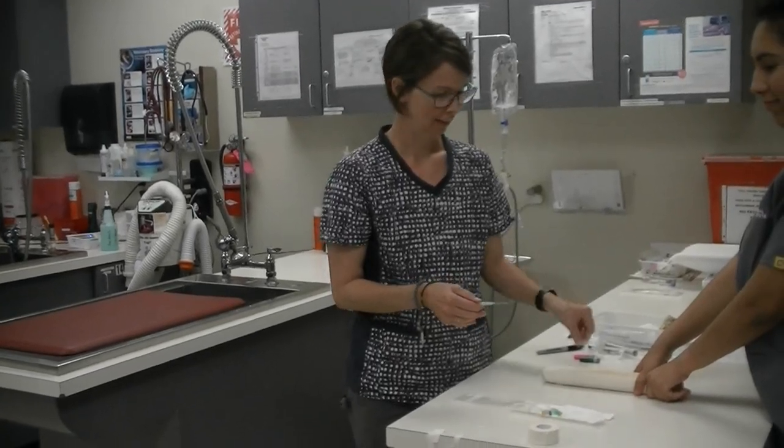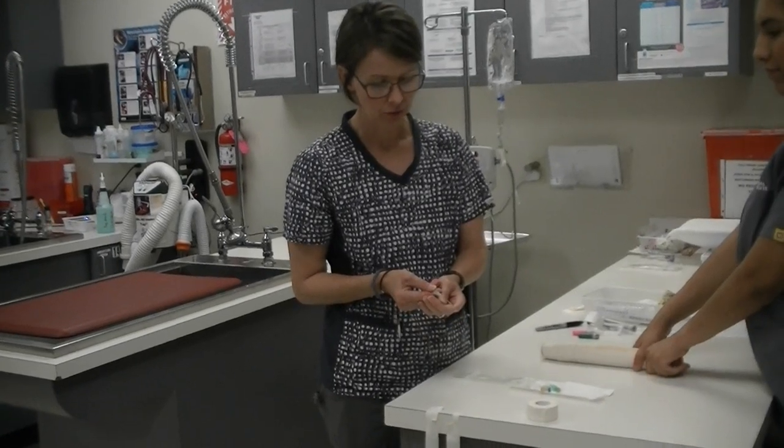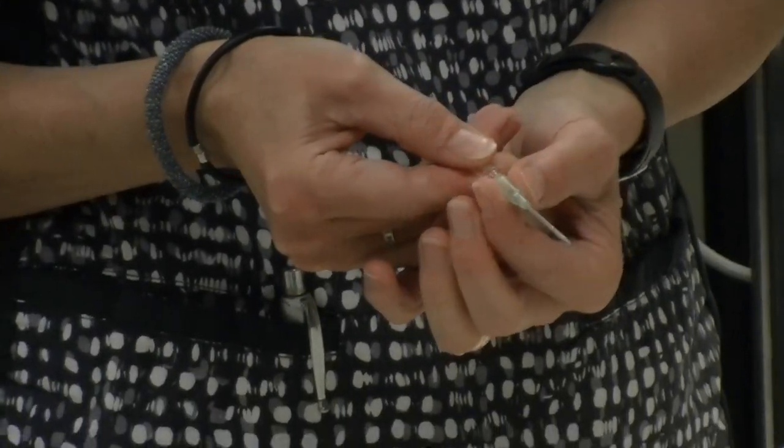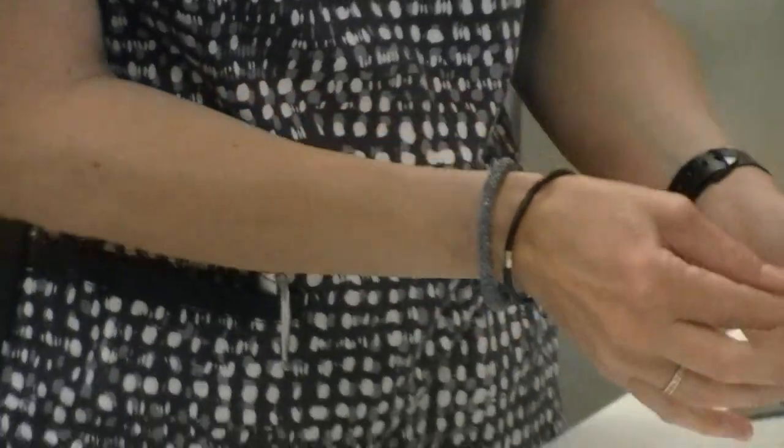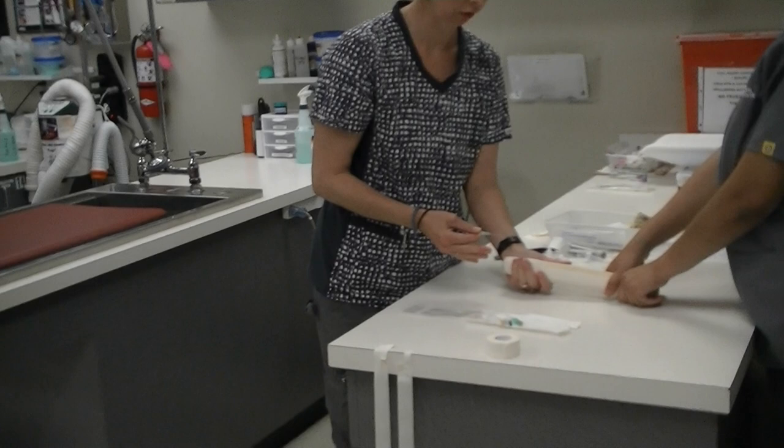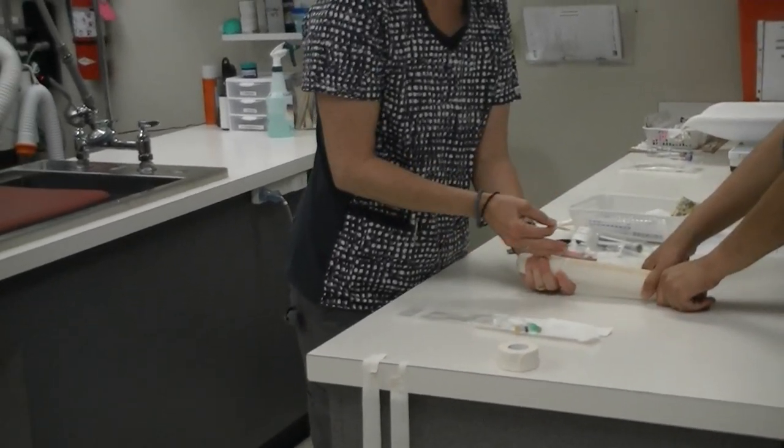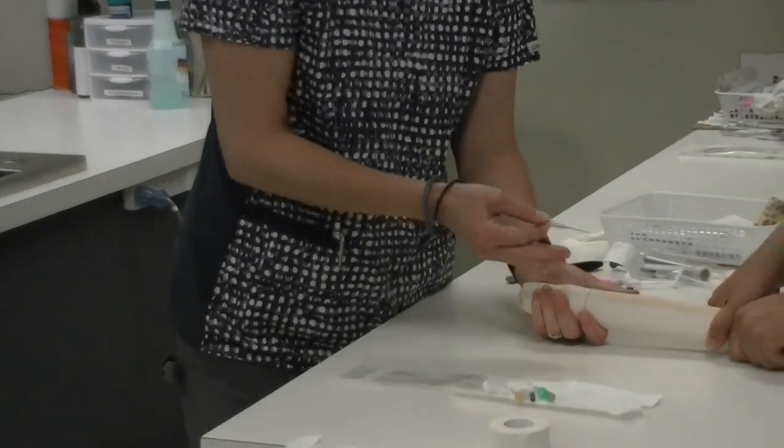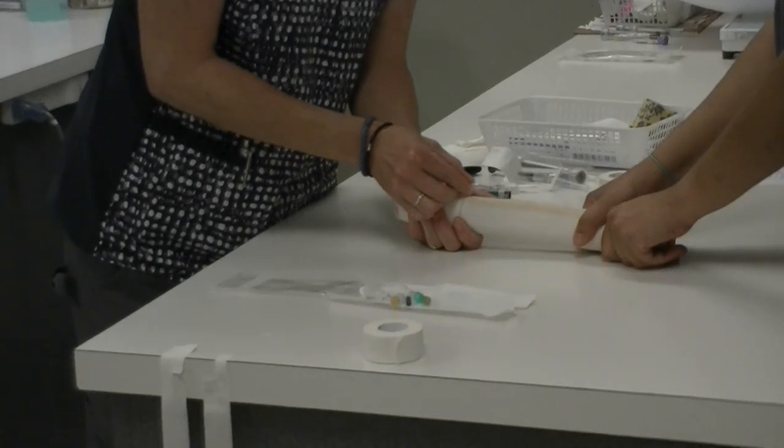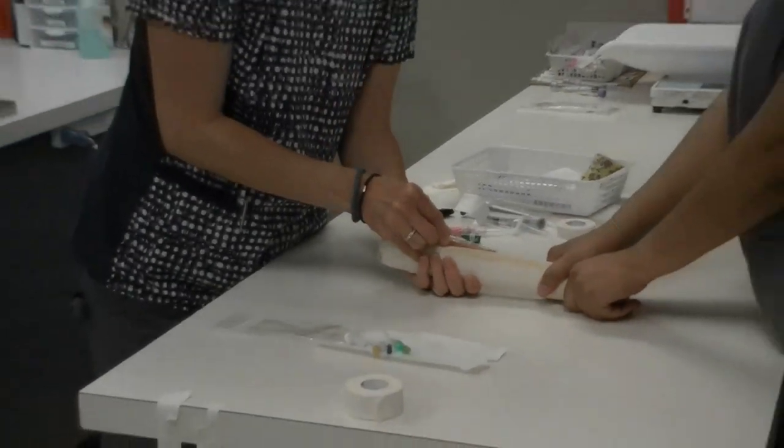Okay, so what we notice is that the stylet sticks out longer than the catheter tip end. This is important to keep in mind when catheterizing. I'm going to secure this leg in my hand and my assistant is restraining the arm as well as occluding the vein.